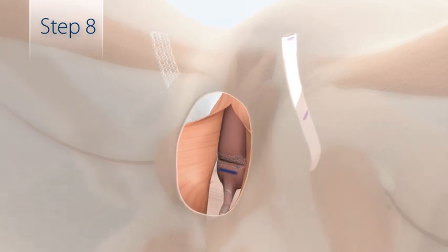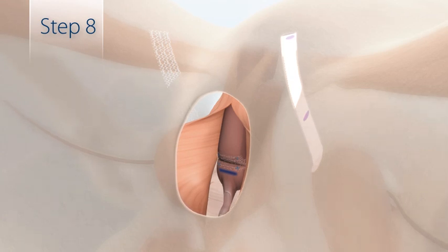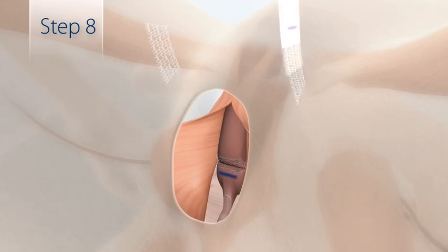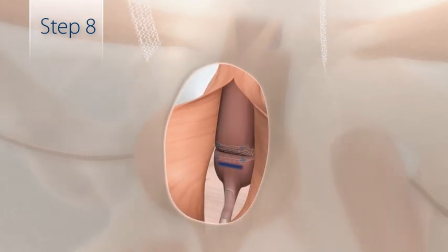Note the sheaths are comprised of 2 layers, a plastic outer portion, and an inner protective Tyvek liner. Both are bonded together to allow for simultaneous removal.